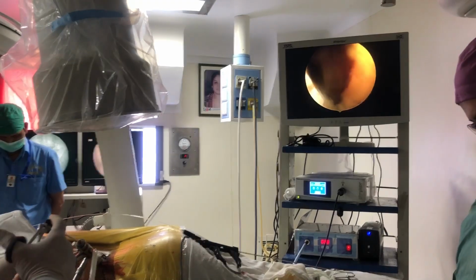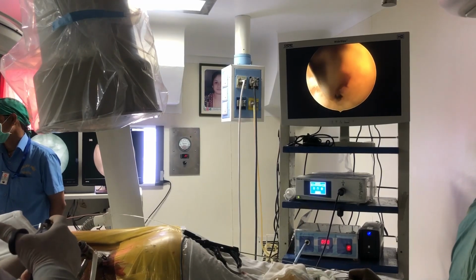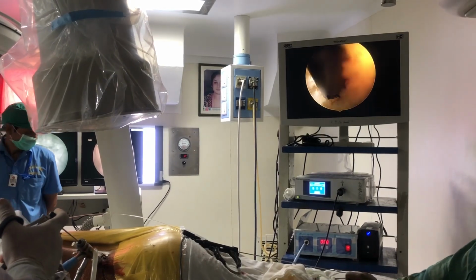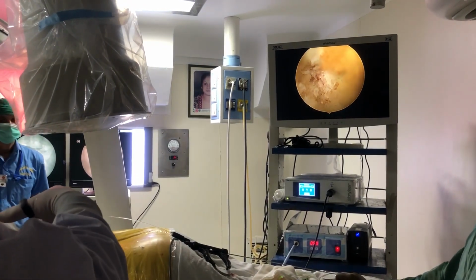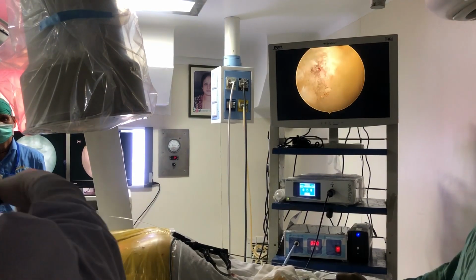We have done a clearing of this entire rent. There are no retained fragments over there now. I am hooking the tear, I am opening it up further, and I am making sure that there is no fragment retained over there. This was the annular rent which was causing the patient all his complaints. Thank you.